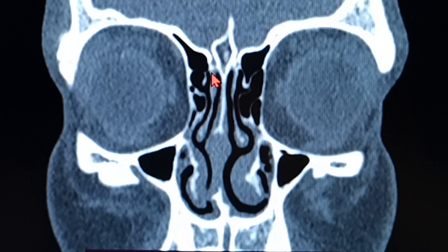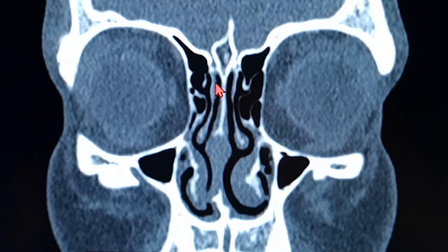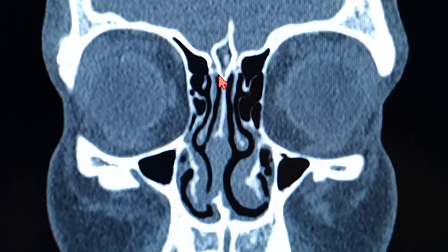Somewhere here, if you do an endoscopy, between the septum and the middle turbinate, you'll see at the very top the yellowish pale mucosa, which is the olfactory mucosa, where the olfactory receptors are present. If you injure that while performing a sphenoid sinus opening with a medial approach, if you go too high, the patient may have blockage over there because of some raw surface.